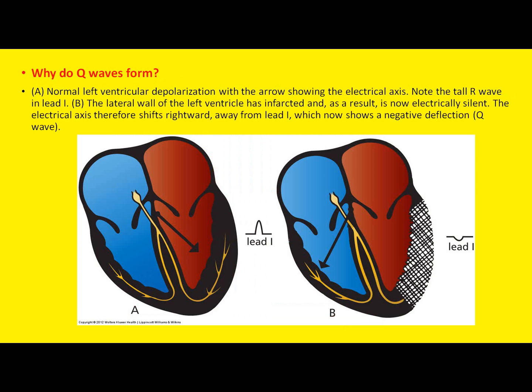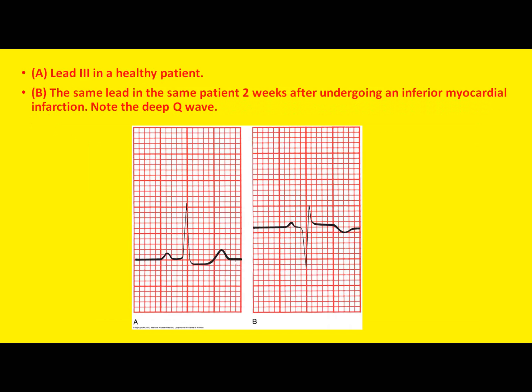All right. So why do patients form Q waves? Well, a Q wave appears once the heart attack has completed. Oh, wait a minute, I forgot to mention that to you.